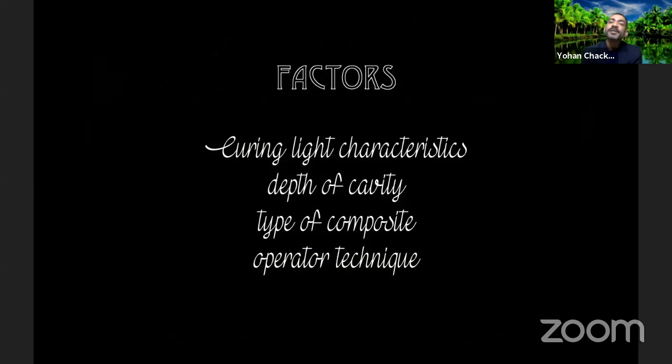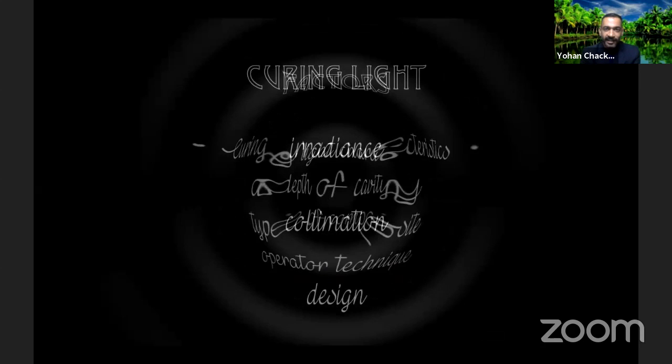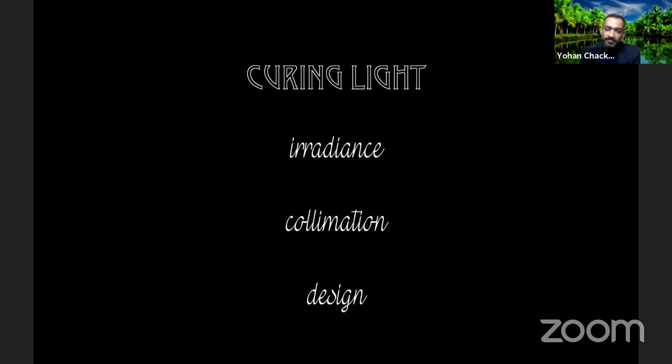The factors that we will be discussing are the curing light characteristics, the depth of the cavity that you are making. Does it play a role in curing? Yes, it does. The type of composite that you're curing makes a difference. And then finally, operator technique. So the curing light has, I've just simplified it a lot for you, just remember these three things. The first one is irradiance. The second is a term called collimation. And the third is the actual design of the curing light.